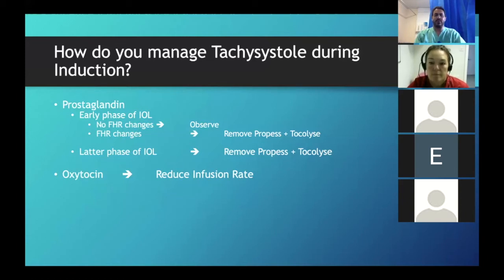Okay? What I'm assuming that you're asking about is the baby that now has a higher baseline, has good variability. You stimulate this baby and it's happy and it's accelerating. Okay, this is a lady that probably has a higher core temperature.